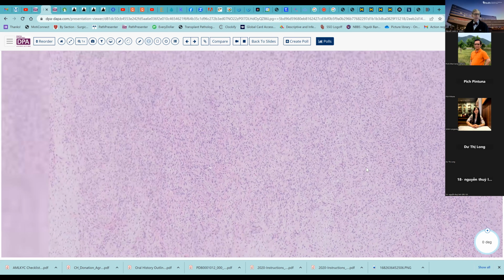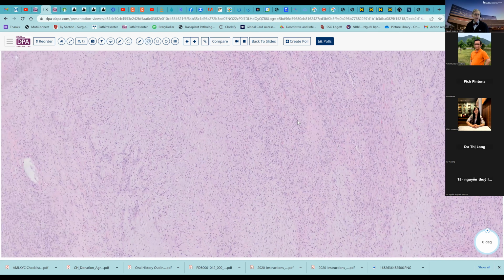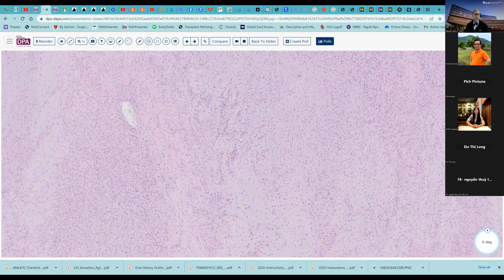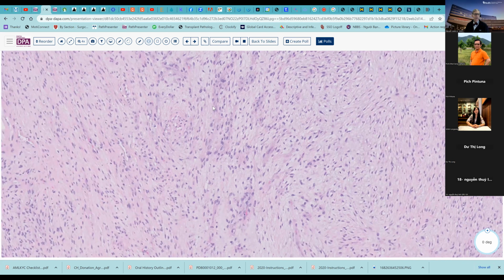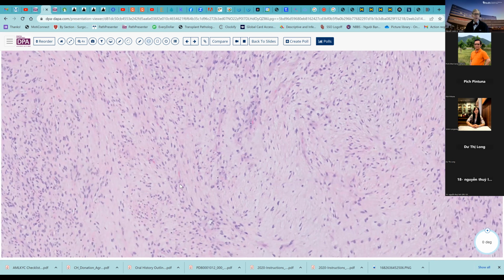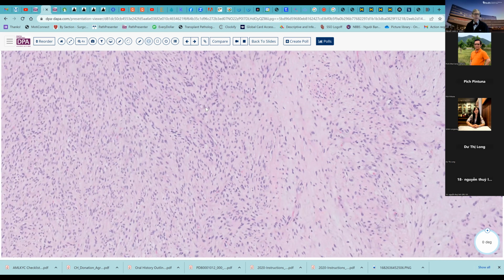Now let's look at the vessels in this lesion and see if you can determine that there's any sort of curvilinear nature to them. Well, here's a few vessels, and maybe they're arching and so forth. They're very small vessels, very delicate, oftentimes very hard to discern.